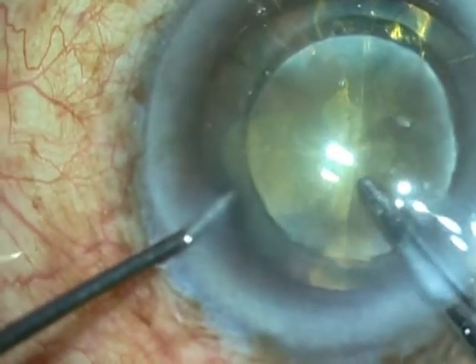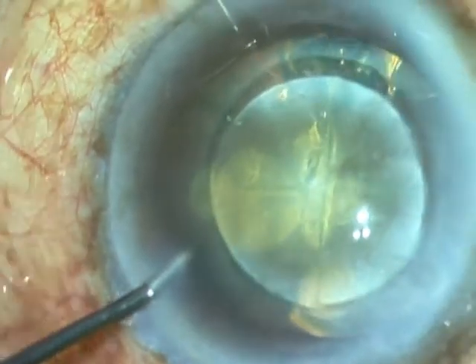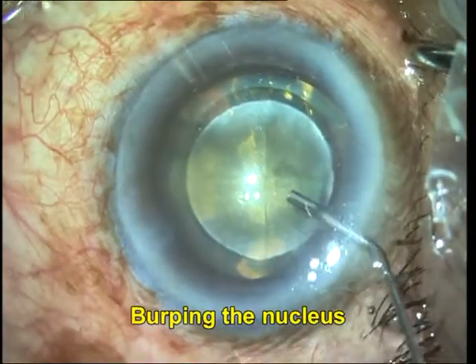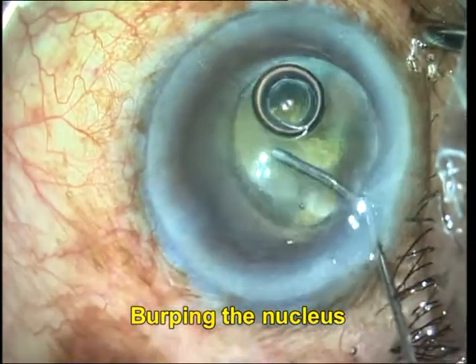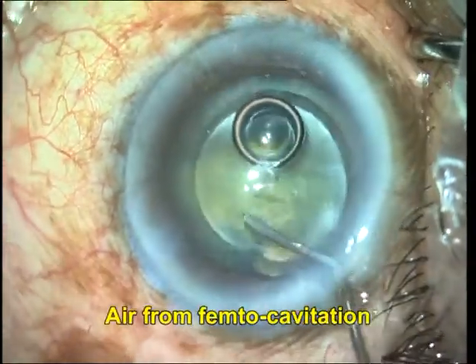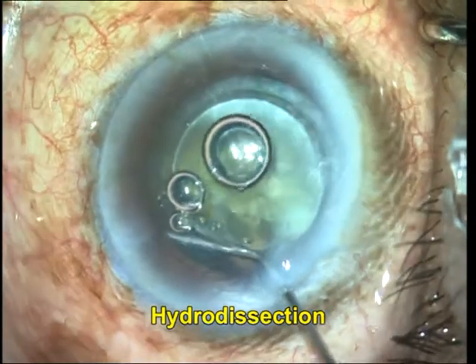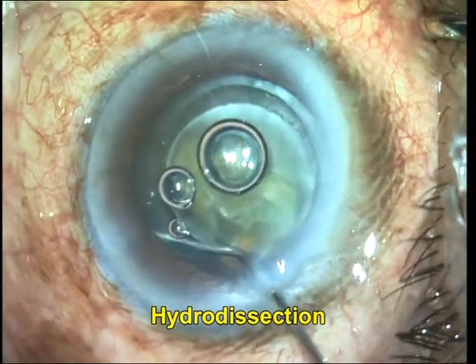A free-floating capsulorrhexis is seen, and it is important to make sure that it is completely detached with no partially uncut segments, in order to avoid a radial runout of the rhexis. Once this is done, the nucleus should be burped because of the presence of intralenticular gas, which can lead to capsular block syndrome and a blowout if hydrodissection is done prior to burping.